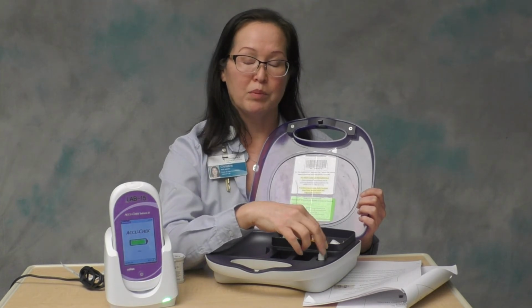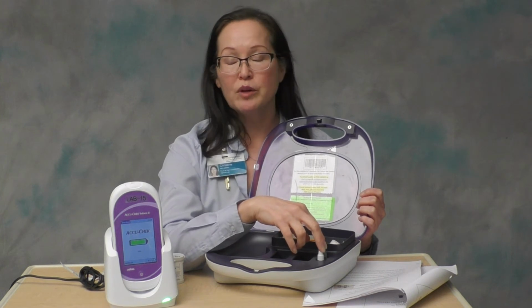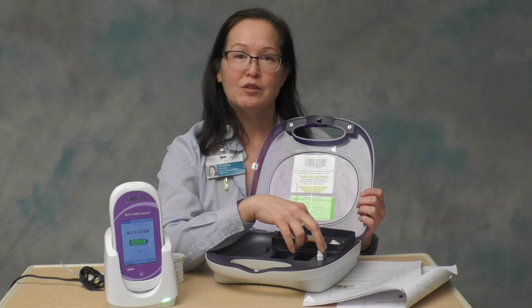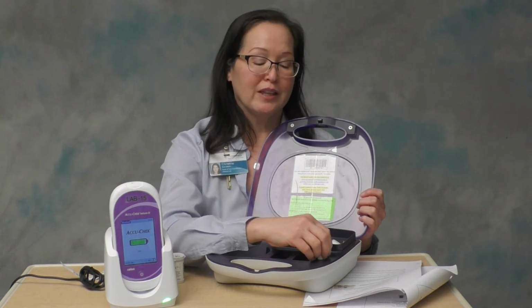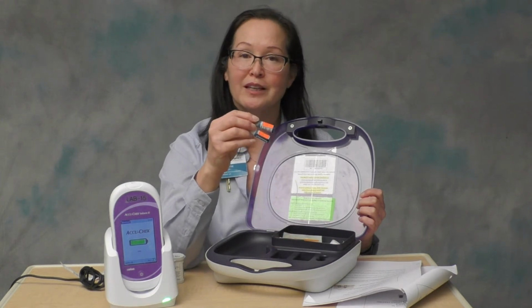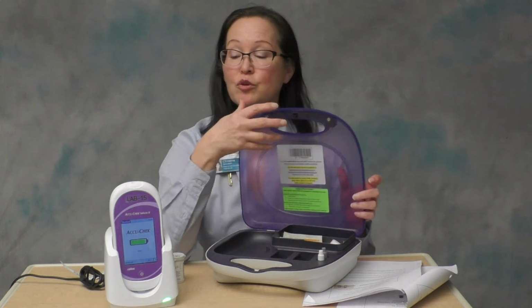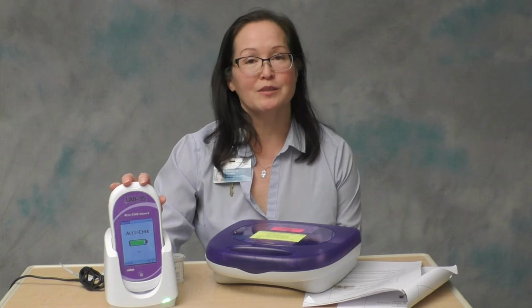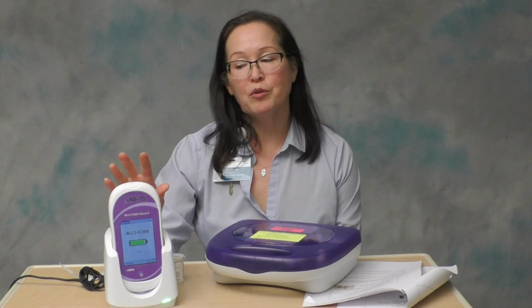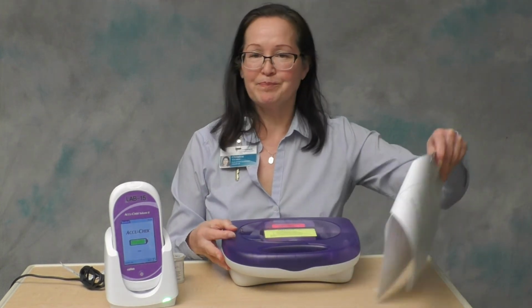Now, our office is open Monday through Friday, 7:30 a.m. to 4 o'clock in the afternoon. So if outside of those hours you need to obtain additional control solutions, you can call the main laboratory. They have a supply of appropriately labeled control bottles in the main laboratory. They also have a spare instrument in the main laboratory in case your instrument gets broken. So you can obtain both a spare instrument or control solutions from the main laboratory 24/7 if our office is closed.